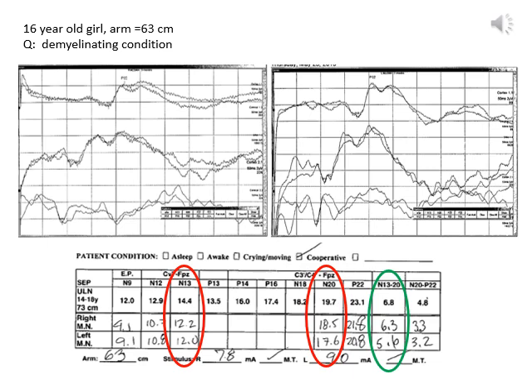And so, for example, for the right median nerve, the N20 is 18.5, the N13 is 12.2, the difference is 6.3. And this 6.3 tells us how long it takes to travel from the generator of the N13 at the cervical spine to the first cortical response. So it's the travel time up the spine through thalamocortical tracts to the cortex.